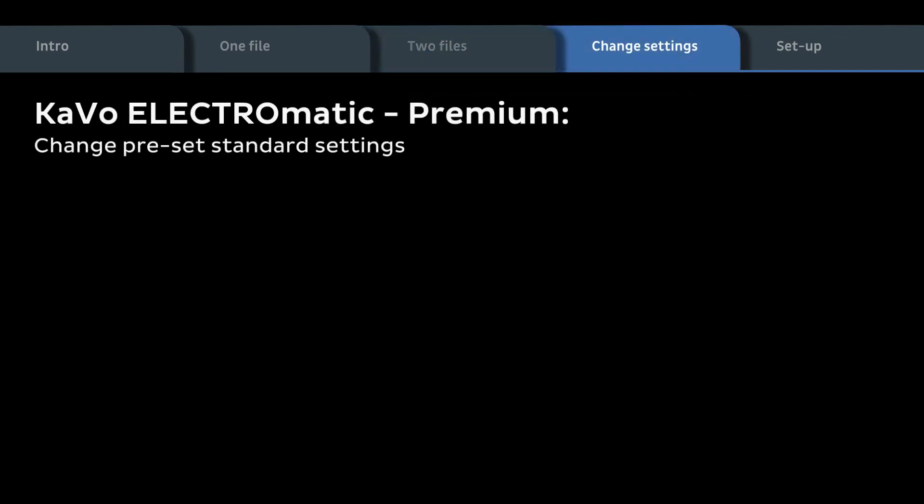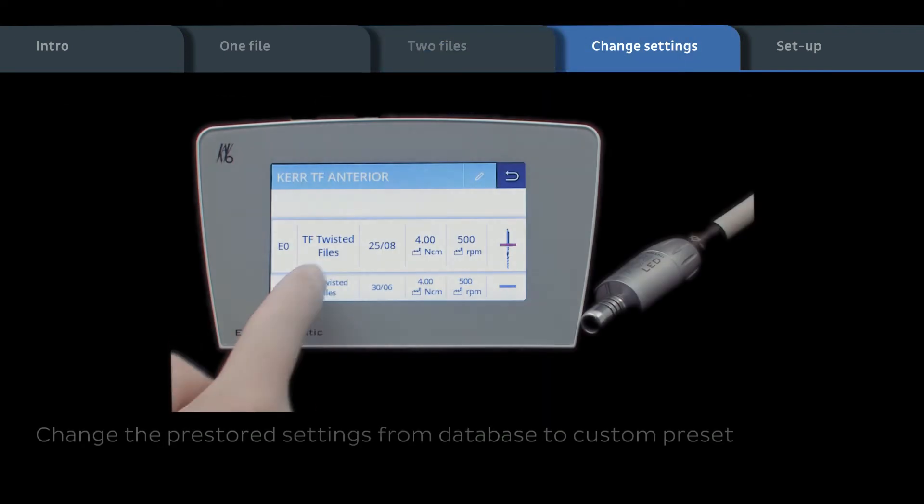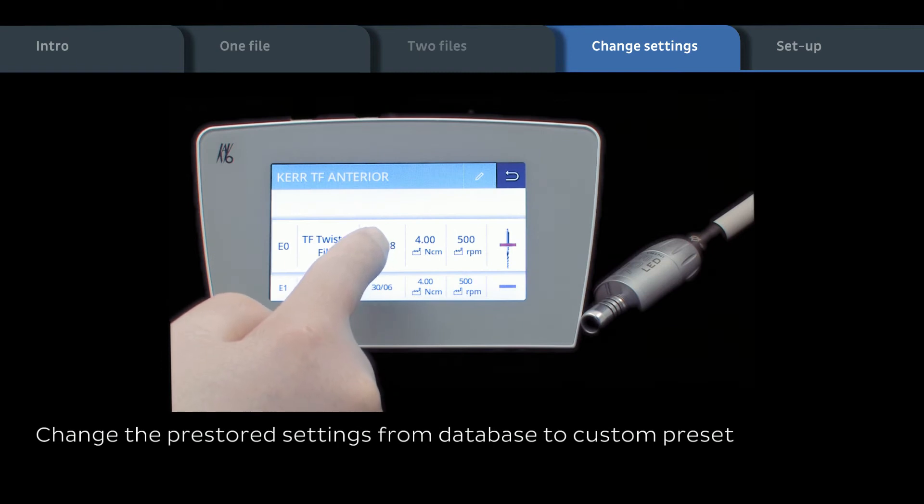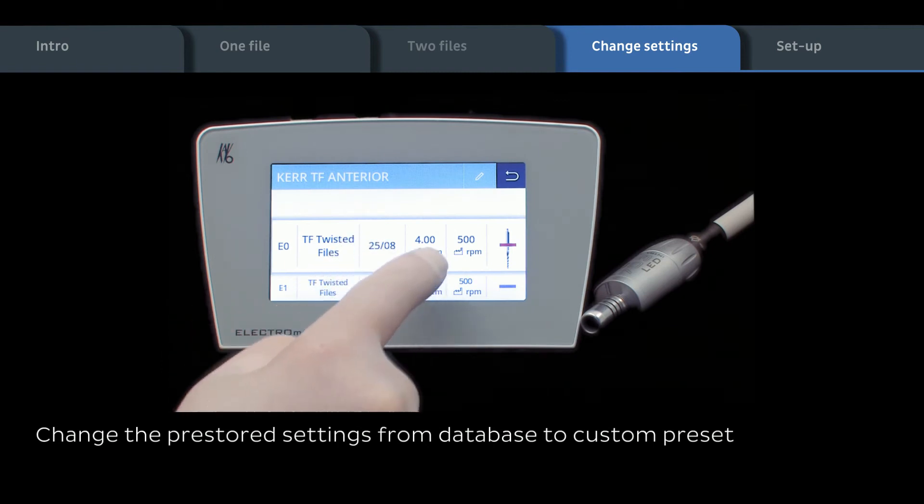Change preset standard settings. General change of preset settings only in the file menu.